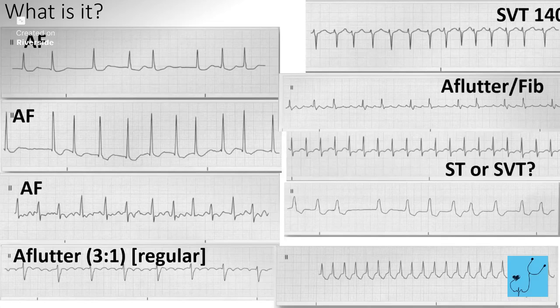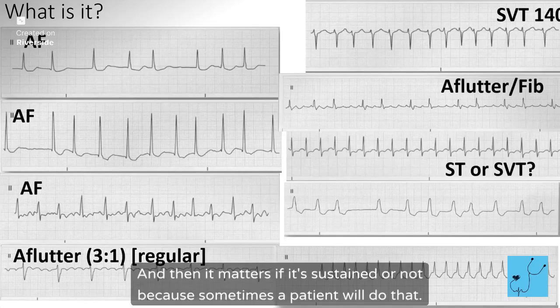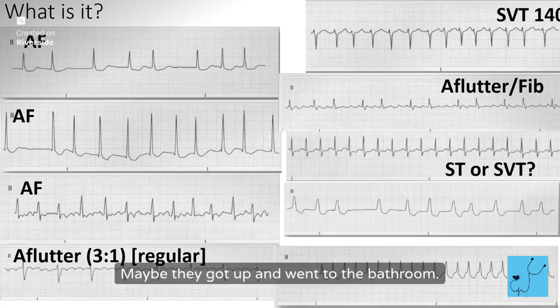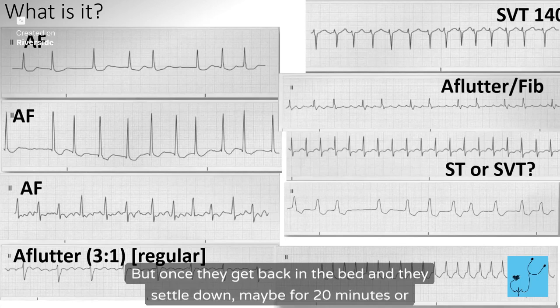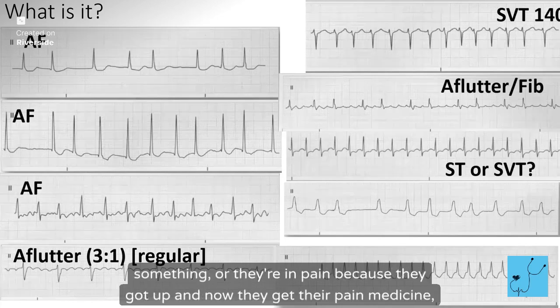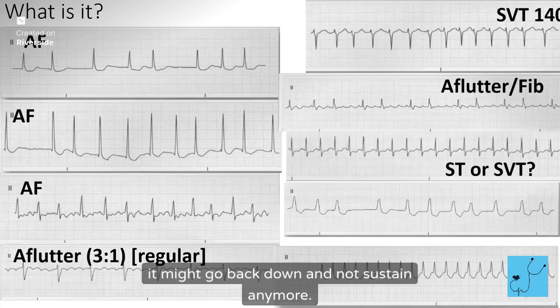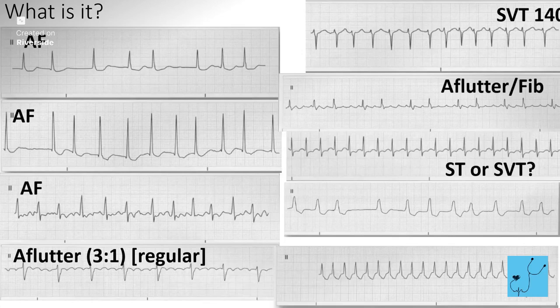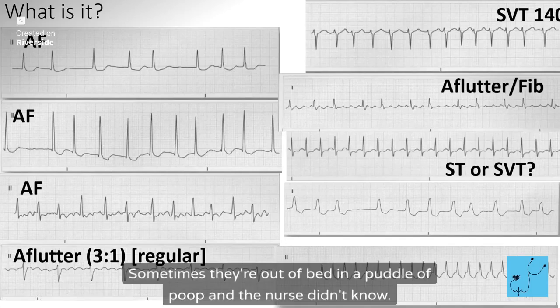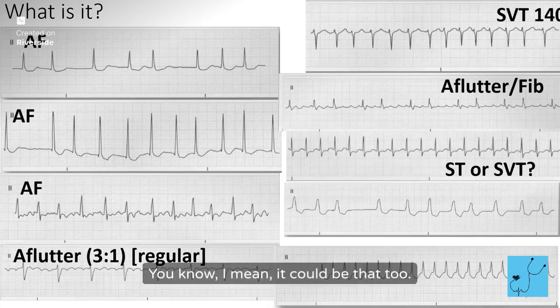Okay. And then it matters if it's sustained or not, because sometimes a patient will do that. Maybe they got up and went to the bathroom, and when they get up and do activity, their heart rate goes up. But once they get back in the bed and they've settled down for maybe 20 minutes, or they're in pain because they got up and now they get their pain medicine, it might go back down and not sustain anymore. But we still need to notify the nurse because we can't see the patient. We don't know what they're doing. Sometimes they're out of bed in a puddle of poop and the nurse didn't know. I mean, it could be that too.